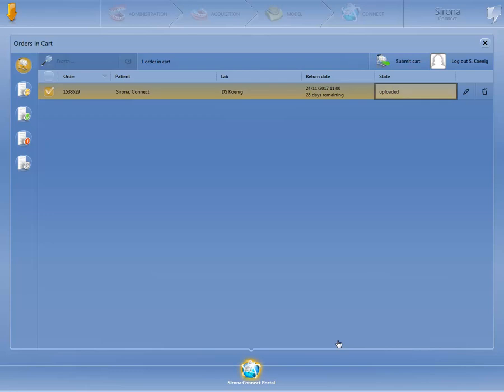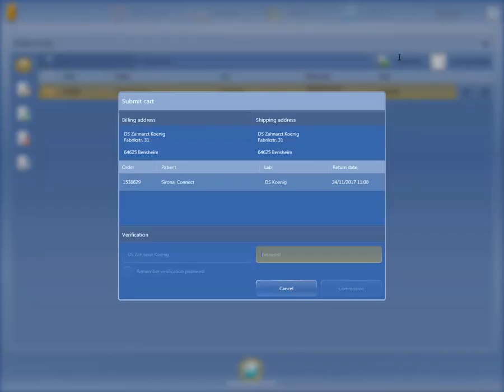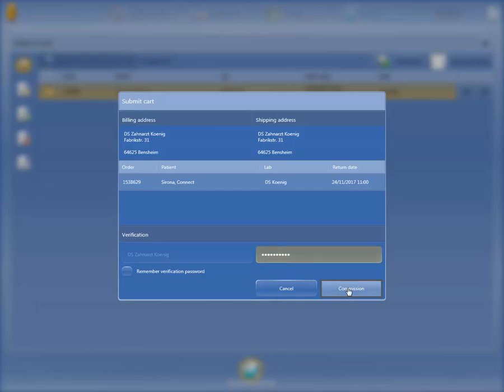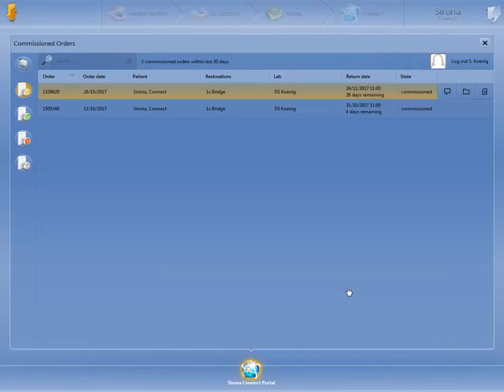The status indicates that the case has only been uploaded so far. To finally place the order, the cart must be submitted. For security reasons, the customer is once again requested to enter the password. Click on Commission to confirm the shipment of the data. The case now appears with the status Commissioned. To return to the Sirona Connect software homepage, the dentist clicks on the username — in our case, Logout S. Koenig.